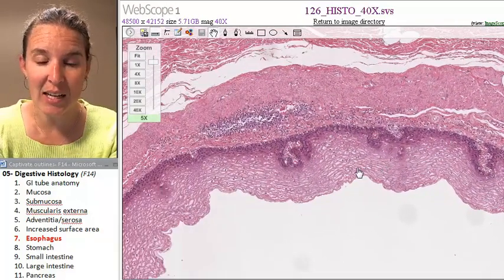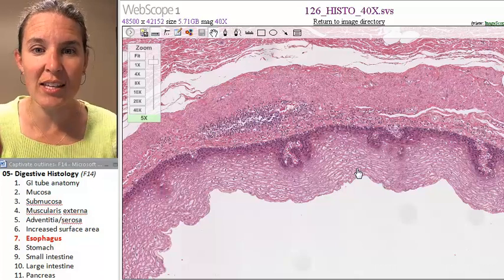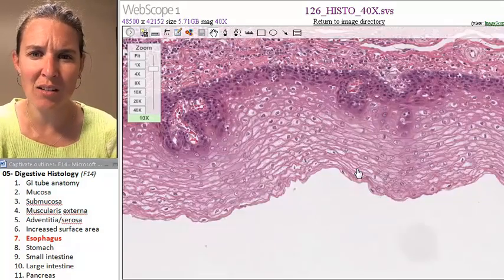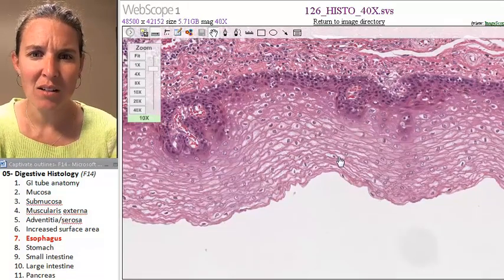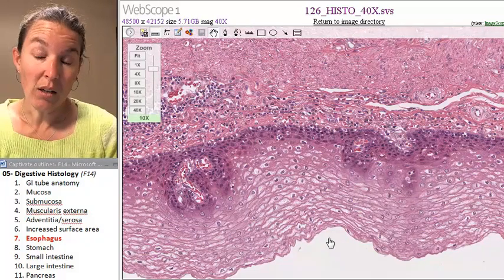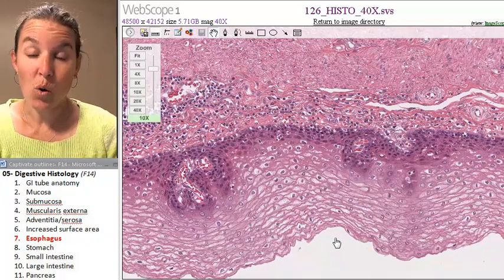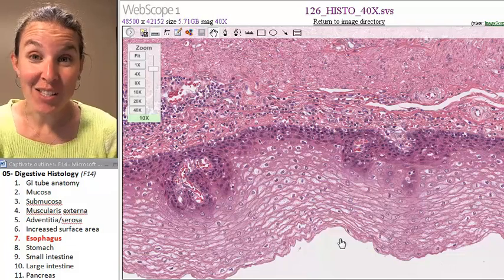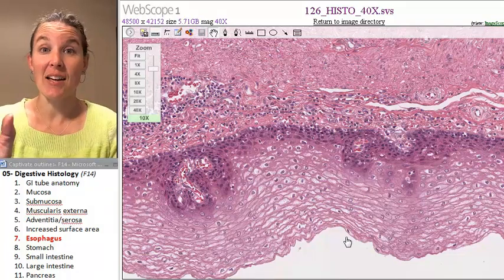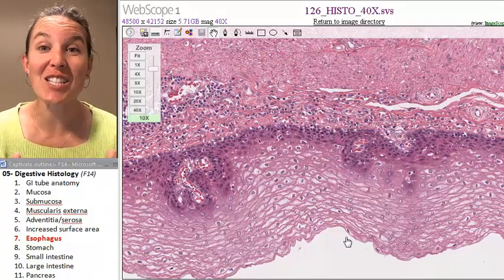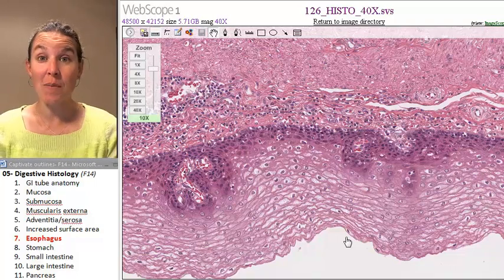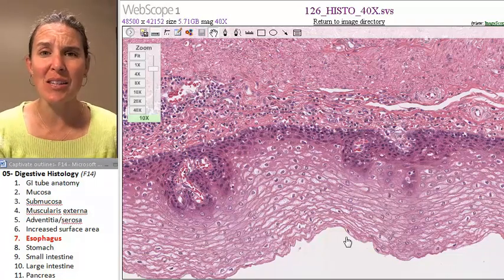You're in the esophagus. What kind of epithelium do you see here? What does that look like? It is quintessential stratified squamous epithelial tissue. First things first, check the epithelium. If it's stratified squamous, you know you're in the esophagus.